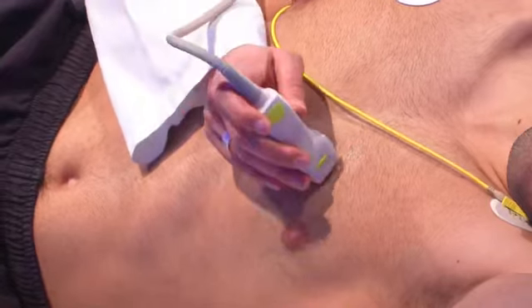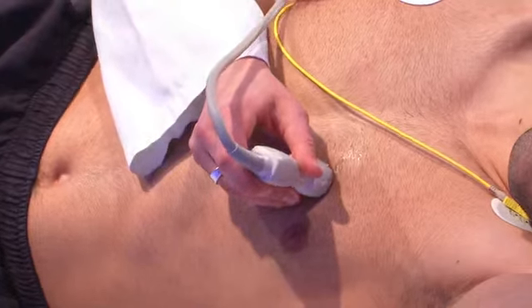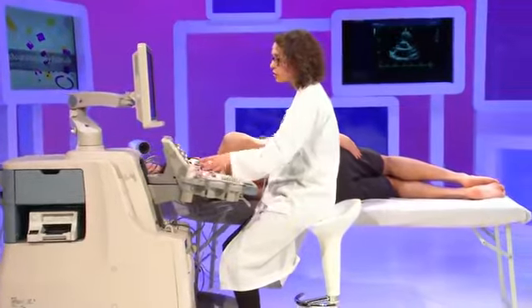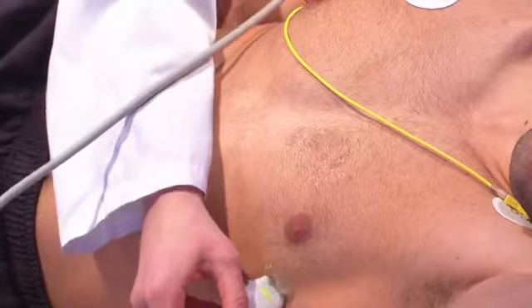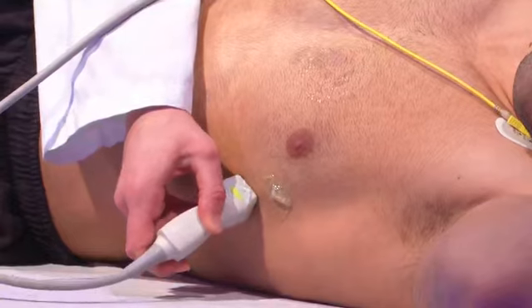In short axis view, I can sometimes acquire a Mmode, but it's currently not recommended to have a Mmode of the aortic valve or the mitral valve, so now it's not recommended anymore. So I will move to the apical view again in order to assess the tricuspid annular excursion and the mitral annular excursion.